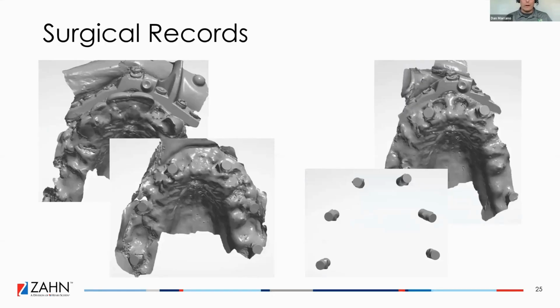Here were the surgical records as they were coming in. The top left at the time, he was using a Yomi, so that was a fixated attachment for that, and we used that for our alignment points.